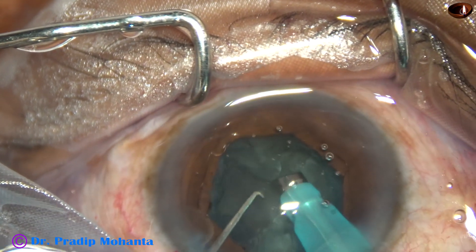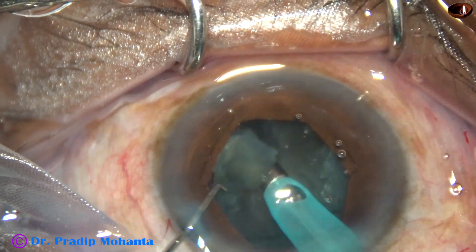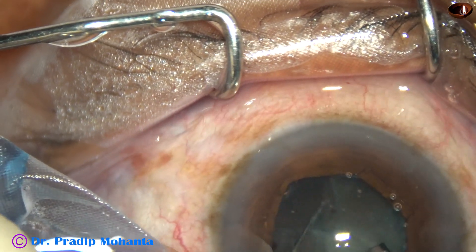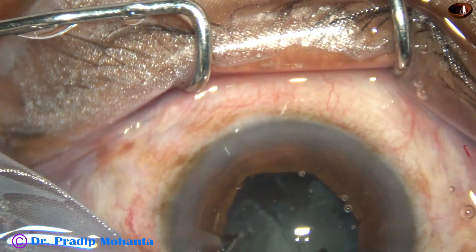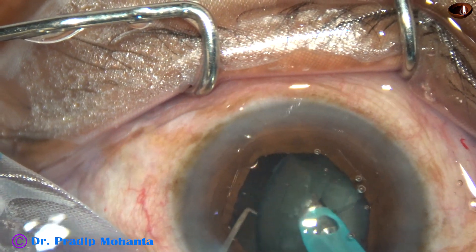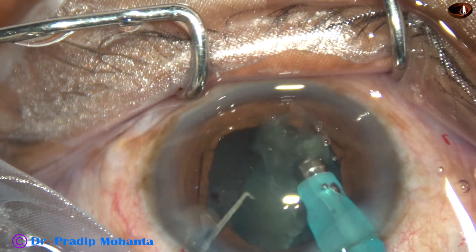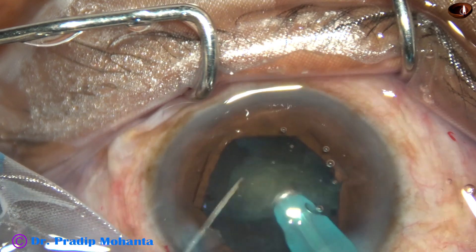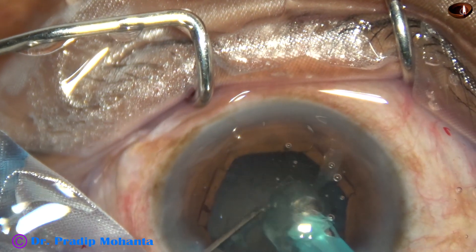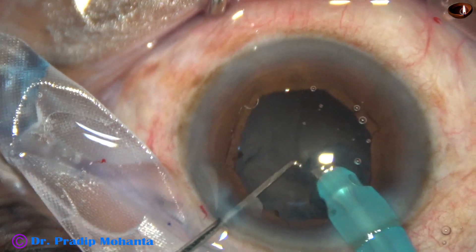We can tilt the nuclear piece, and as we try to catch it, we must be sure that there should be a lot of thick lens material in front. Otherwise, we can just eat off the thin plate of lens matter and catch the posterior capsule. We can tilt the lens material like this and then it becomes safe. And this is the last portion of the nucleus — and it is done.